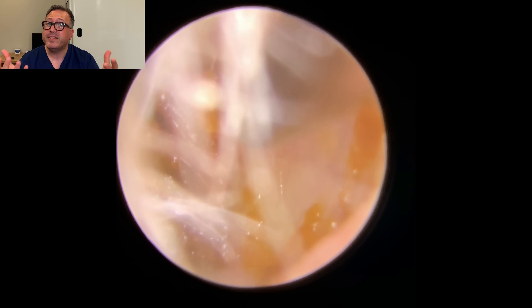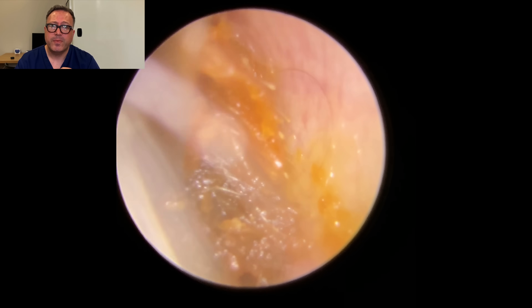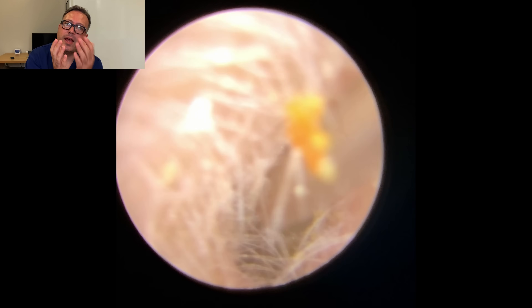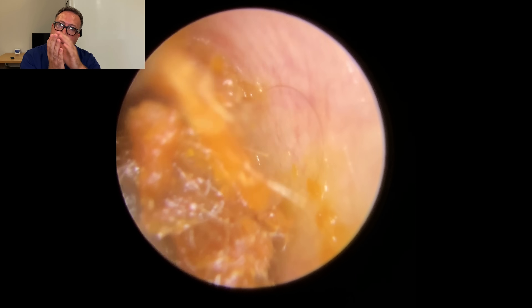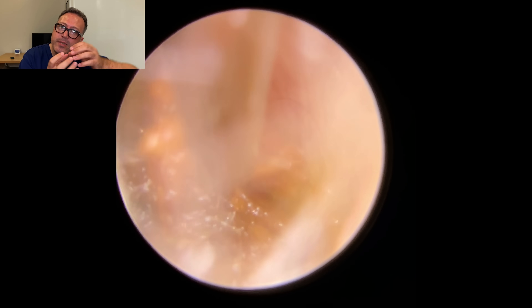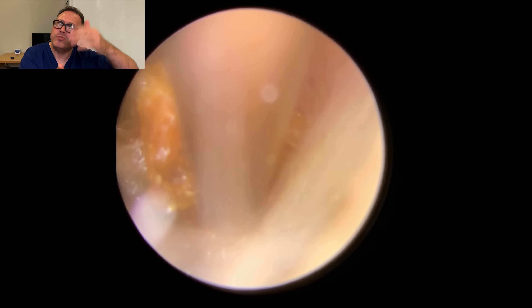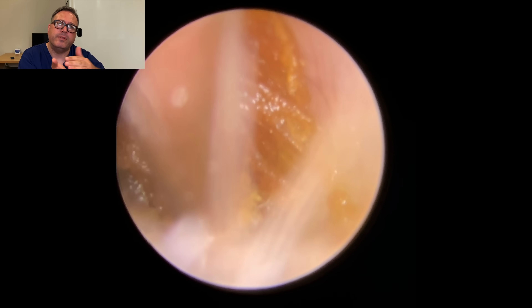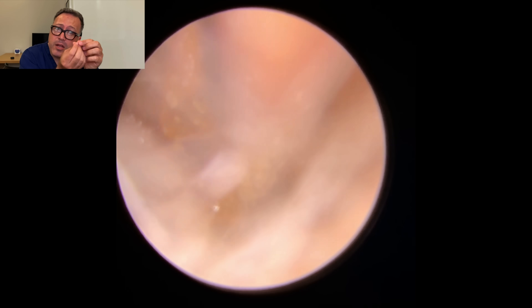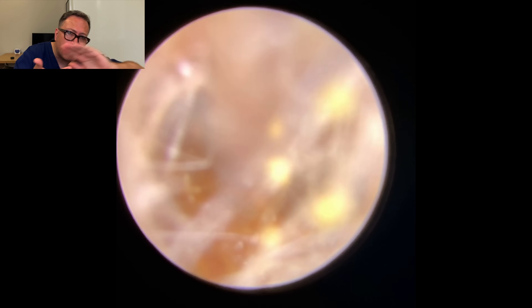As you can see, this is the second ear — we've got a very similar issue going on in here as well. There's very sticky, honey-colored wax and skin debris here. You can tell how tough the wax is by when you do get a grip on it, how quickly it folds back into place. You can actually see one of the skin ribbons here — can you see how it bends and moves? The slight translucency and the little ripples running through it — it's almost like amber, like a really, really thin piece of amber. And that's when you know it's these kind of skin issues going on in there. You can see how that piece of skin folds and interweaves with the wax underneath.